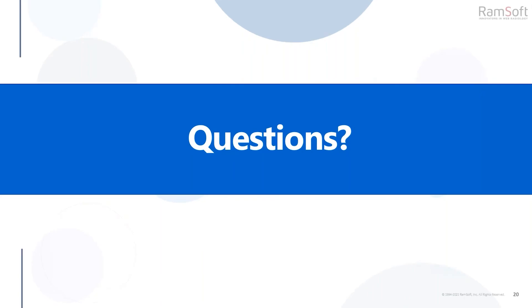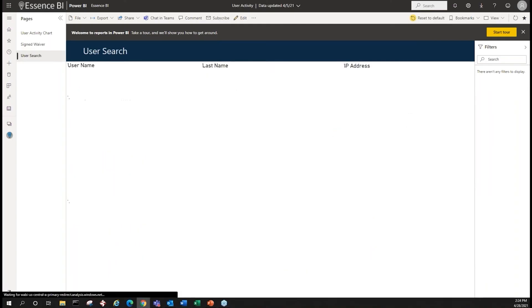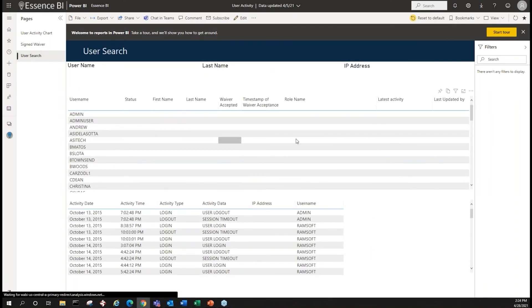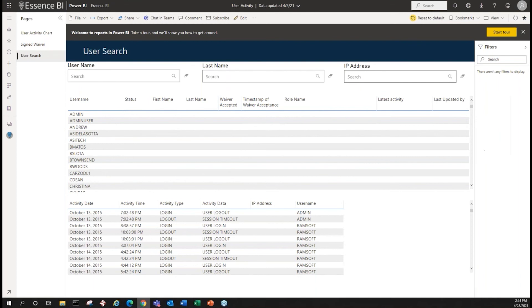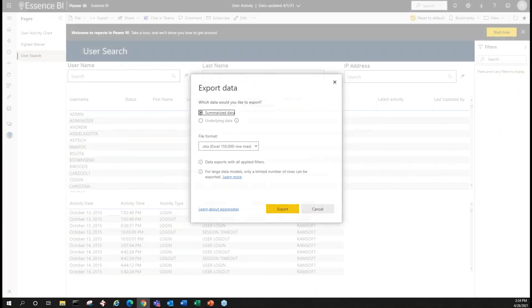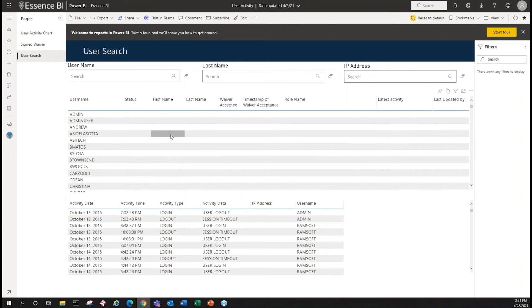Another question: can we export reports to PDF? Yes, reports are exportable to either PDF or CSV. The export function is here — you just hit 'export data' and you're able to export it out.